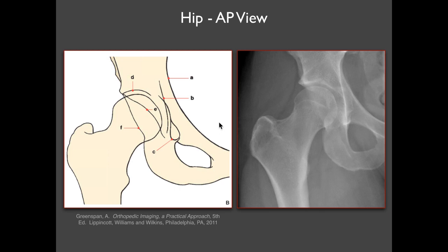Back to the standard AP view of the hip — the key structures to identify are shown in this cartoon: femoral head, greater trochanter, lesser trochanter, and the same anatomy on the radiograph. You have the femoral head-neck junction and the physeal scar. The hip joint space is this lucency between the femoral head and the roof of the acetabulum. This sclerotic line is called the sourcil — an area of normal sclerosis due to the weight-bearing surface of the hip. It's important not to over-interpret that sclerosis.